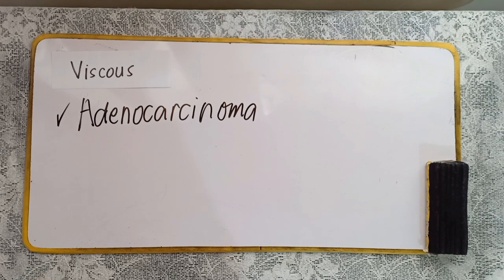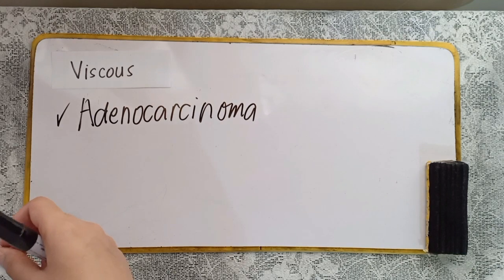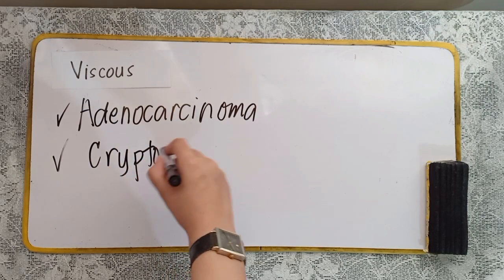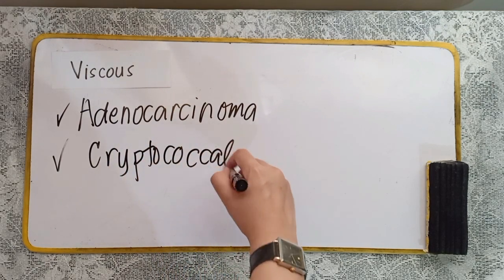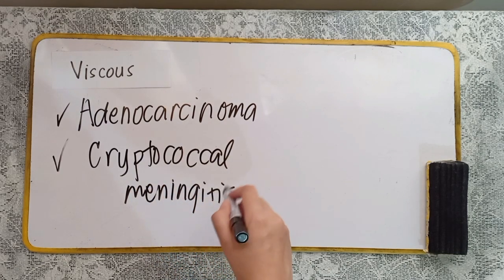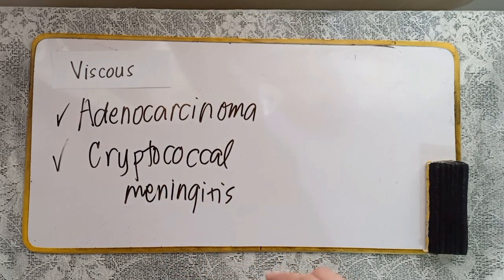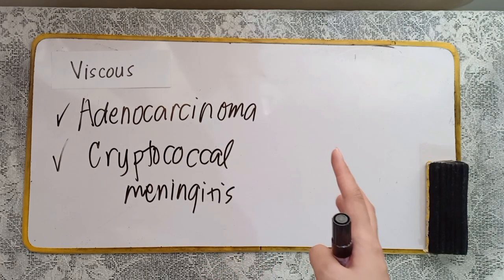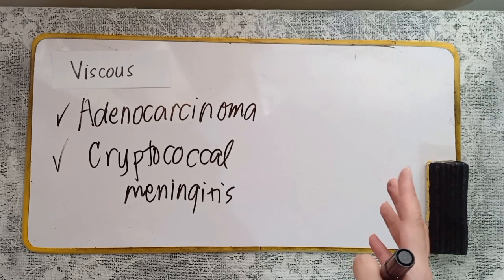Or you can also see it in patients with cryptococcal meningitis. Now, these are the pathological causes of a viscous CSF sample.